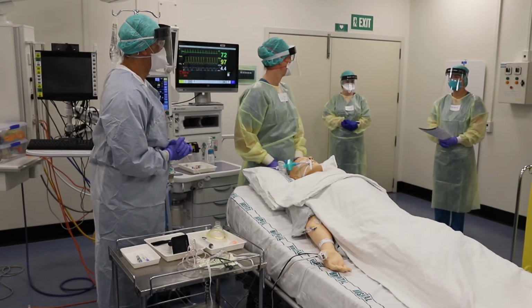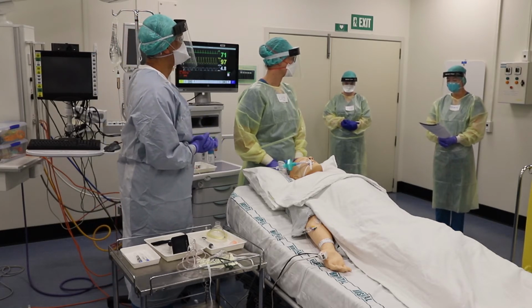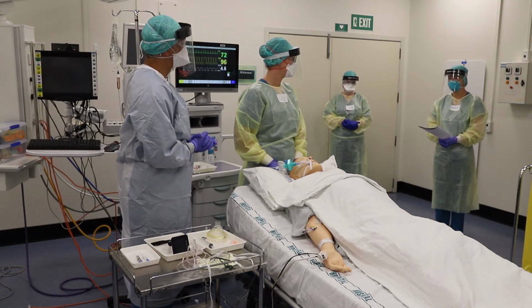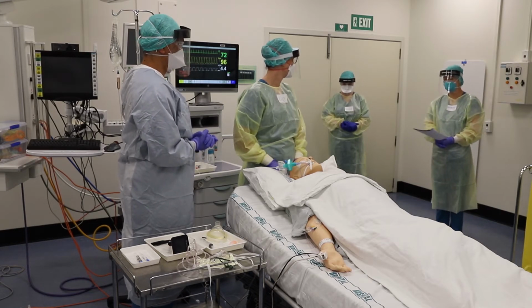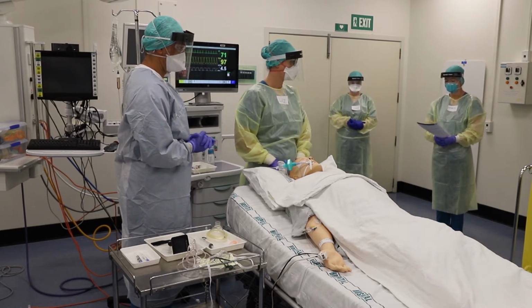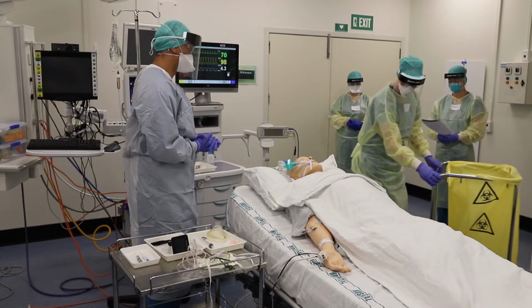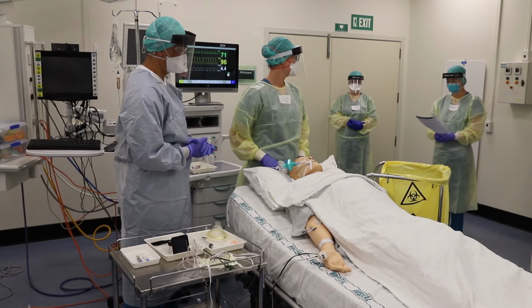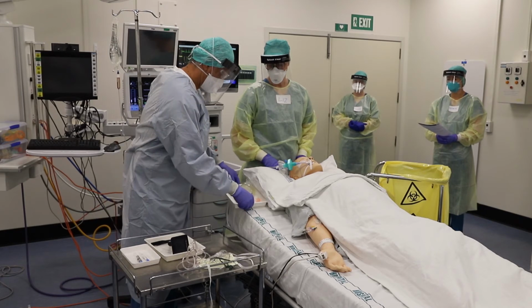Are we ready to begin the extubation process? Yes. I will read each instruction aloud and then pause for the action to be performed. Please confirm verbally when each action is complete. I'll just check that Olivia and I are more than 2 metres from the patient's head. Yep. Rubbish bin on the left within easy reach of an anaesthetist. I'll get that. Airway tray with face mask, Yankauer and syringe on right side of patient. Thanks, Chris.